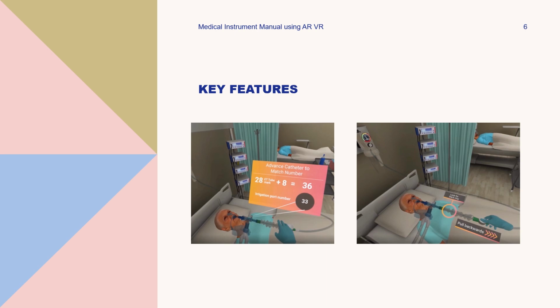But how this manual will work will also be guided using guiding messages. You can see on the right of this image, we are giving guiding messages on where to pull back this particular tube.